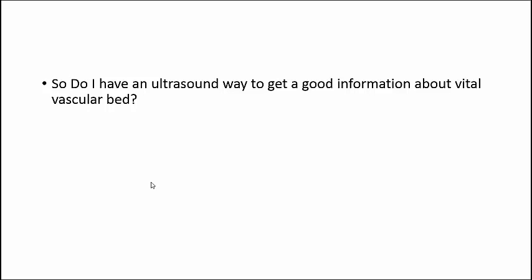So, do we have an ultrasound way to get good information about the vital vascular bed? The future treatment of shock will be looking for the vascular bed of the vital organ, and knowing if there is improvement in perfusion on the cellular level, on the vital organ level, or not. Yes, we have. Very easy to explore it.